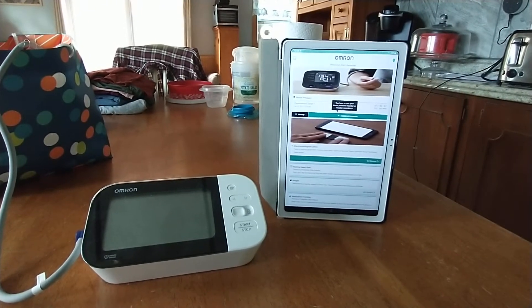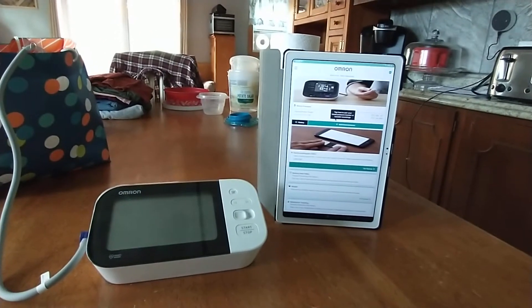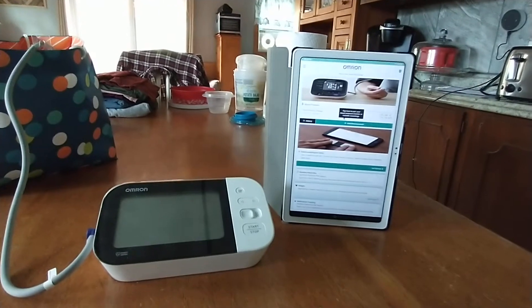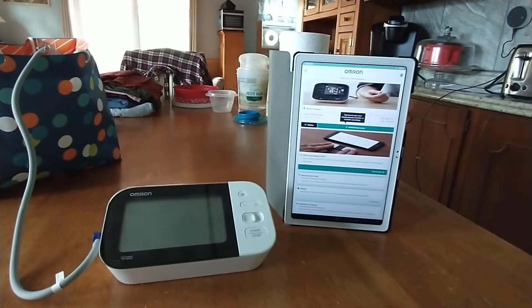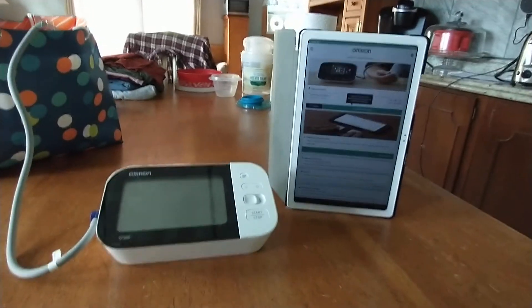My monitor is a BP7350. So everything is unpaired from each other — there's no pairing in the Omron app, there's no pairing on the phone. But I've got the Bluetooth, and I'm going to do this on the tablet. The tablet Bluetooth is on, but nothing is paired.